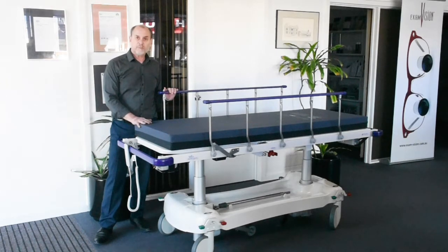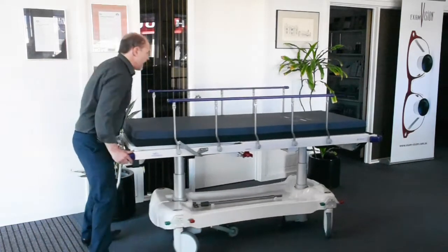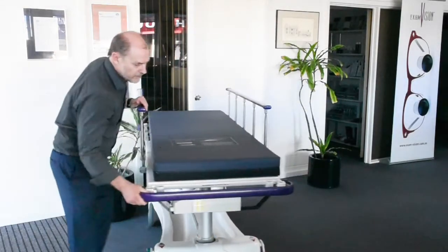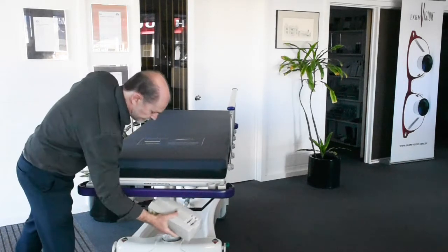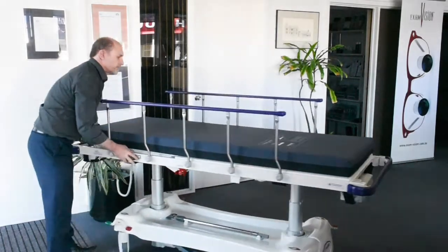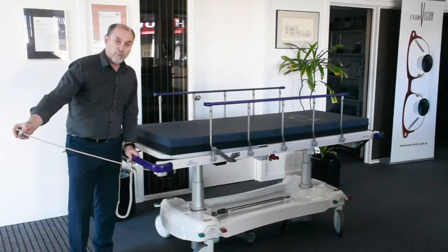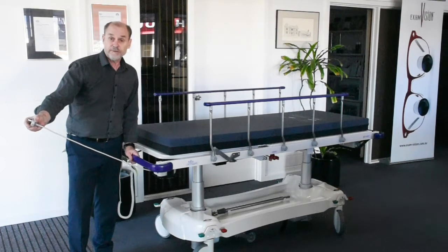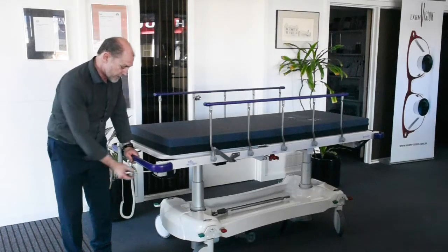The mattress is 100 millimetres thick. It's electric powered, driven by a rechargeable battery which is stored in this case at the foot end, as you can see here. It's easily accessible and can be replaced. To recharge it, connect it to mains power using this retractable power cord. You don't need to have the battery fully charged or even functional to operate it with mains power, which is quite handy.